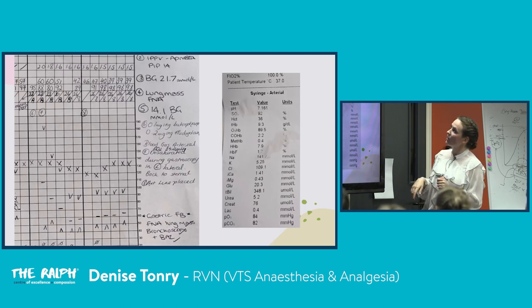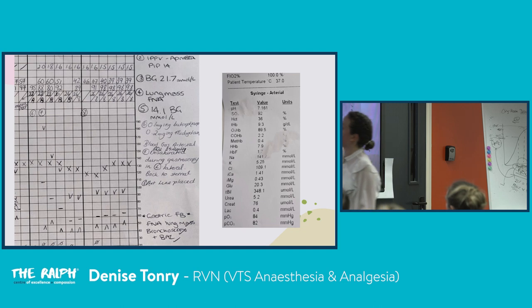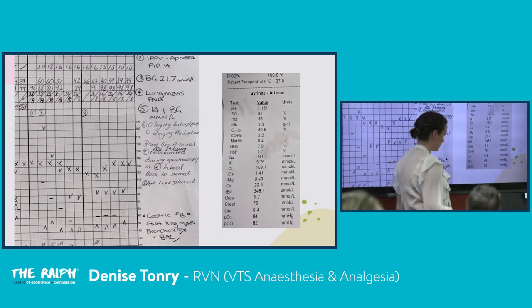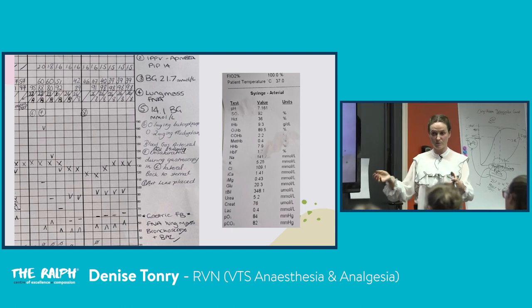And this is a picture of the arterial blood gas that we got. What's interesting is when I was ventilating this patient, I was having an end tidal of 57, and I had a real carbon dioxide level in my blood of 82. So I'm missing carbon dioxide. It's going around the blood, and I'm not managing to get it out through the respiratory system.